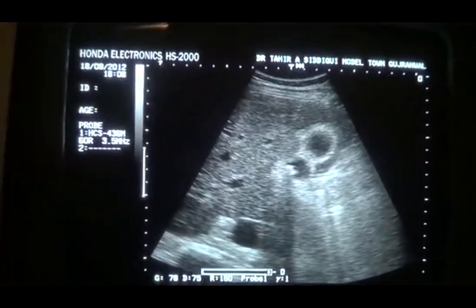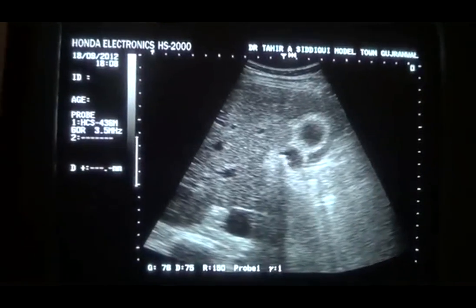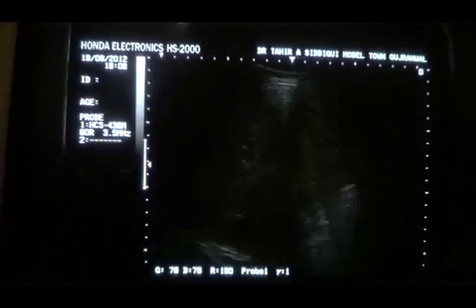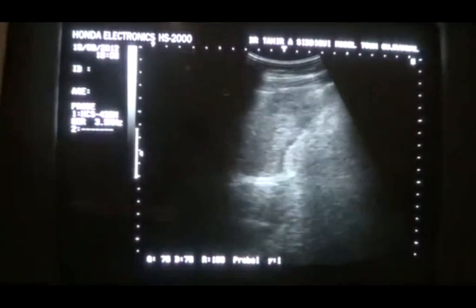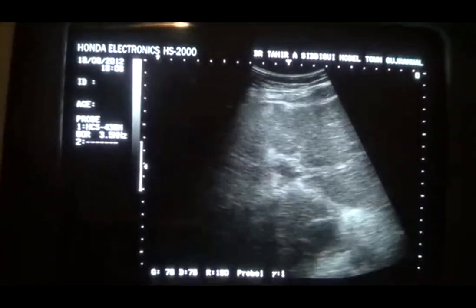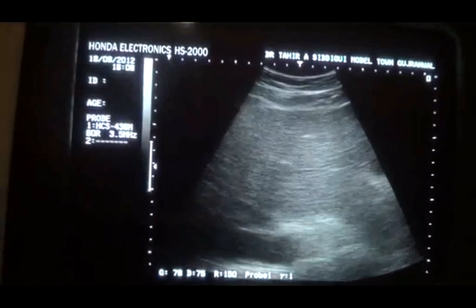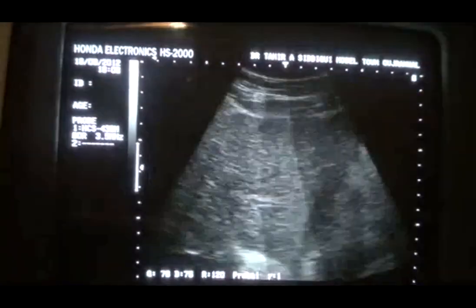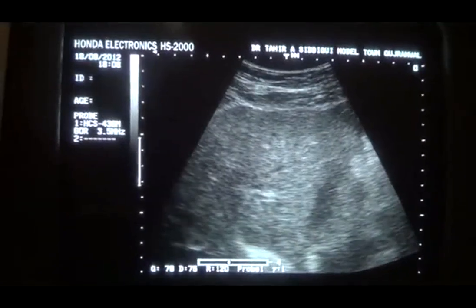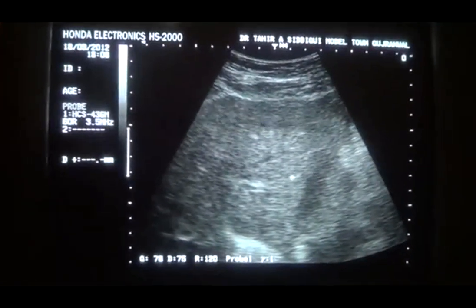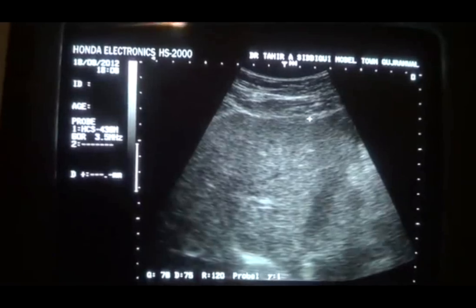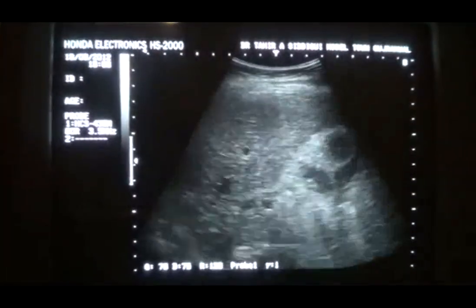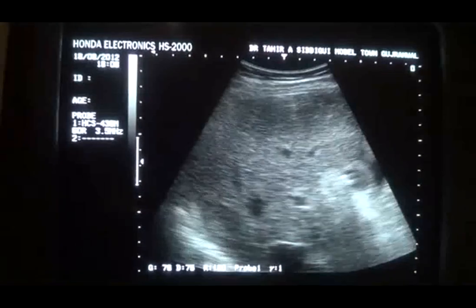This is the gallbladder; it contains few calculi within it. This is the cirrhotic liver. You can still see that the outer surface of the liver is irregular. This is the coarseness, this is the irregular outer surface, and there is fluid around the inferior surface of the liver.